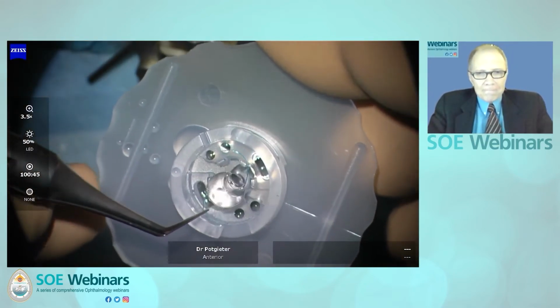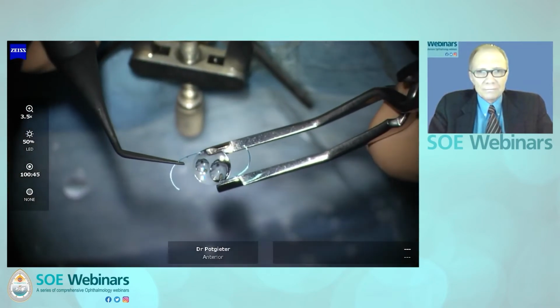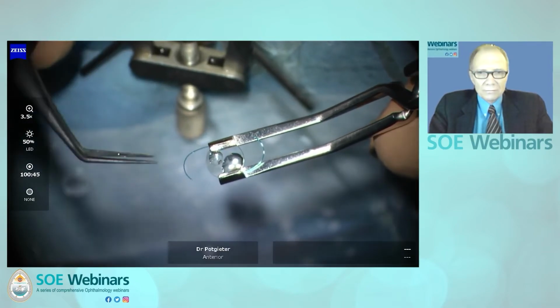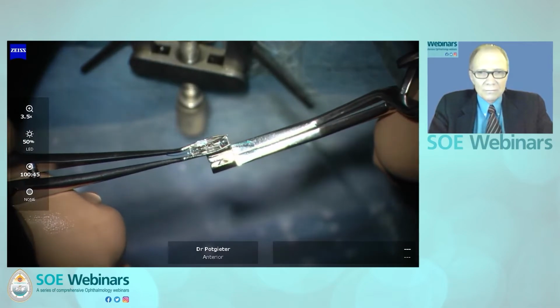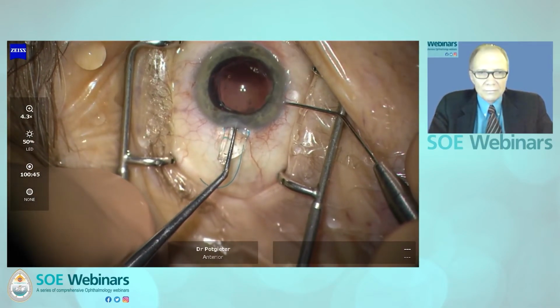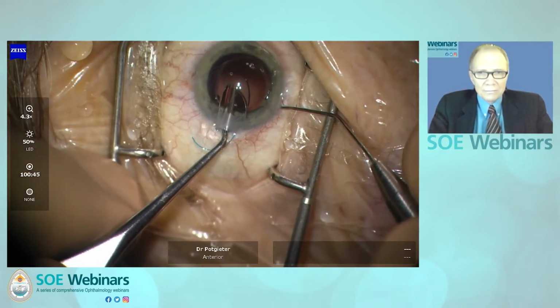An acrylic 3-piece IOL with a 6mm optic was loaded into the folding forceps. We elected to use a folding forceps as it is our experience that PMA haptics of these lenses sometimes would bend permanently when loaded into a cartridge, leading to decentering of the lens.